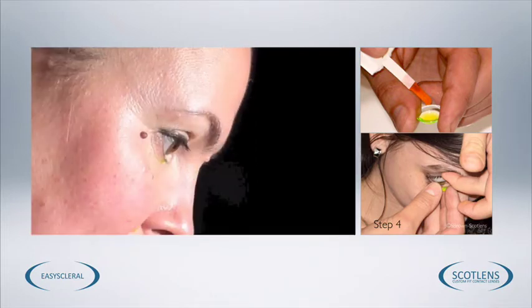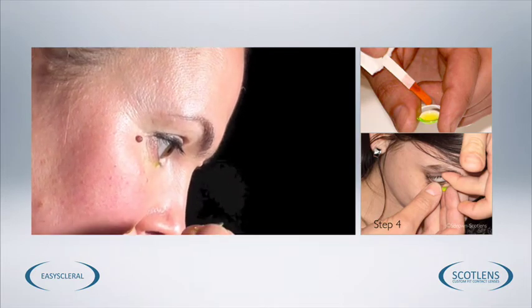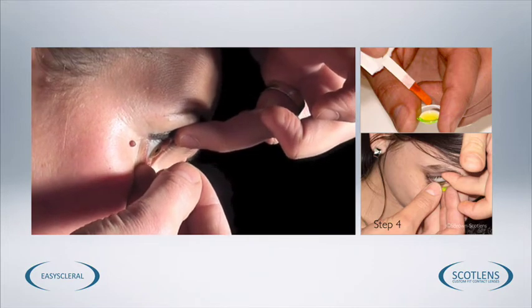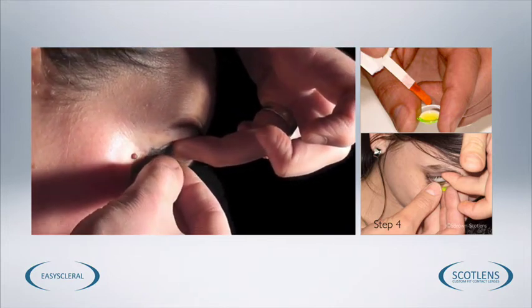Watching the same thing using your fingertips. Fingertips obscure the view slightly, but the principle is exactly the same. And whether you use a sucker or your fingertips is down to personal preference.